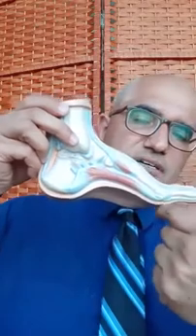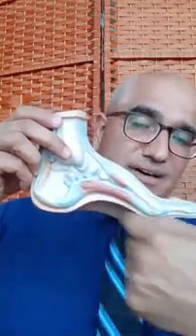So it is very important that we prevent any toe problems. Normally there is flexion of the toes, and we prevent any blisters on the forefoot and heels. For this purpose, it is highly recommended that we go for customized insoles. That means we have to fill these arches with the customized insoles. When we fill the arches, we redistribute the foot weight properly, and there's less impact on the heads of the toes and on the heel.